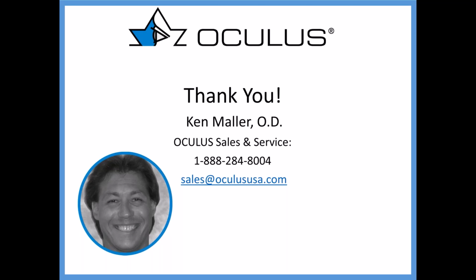The other thing I'll say, when it comes to difficult scans where the auto alignment has failed, if you are having trouble on a severe pathology patient because auto captures failed, Oculus and my department, the clinical application department, does offer a training on taking manual scans. So go ahead and reach out to us and we'll help you out.